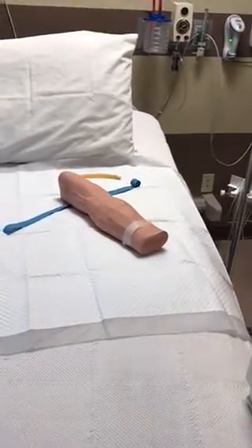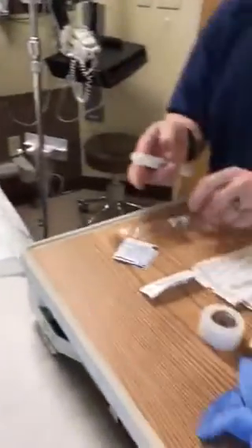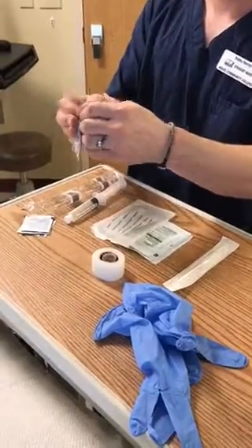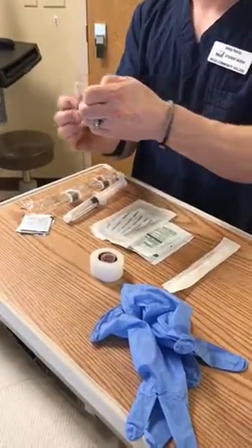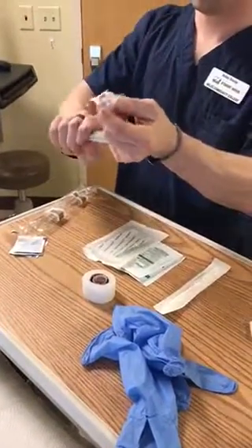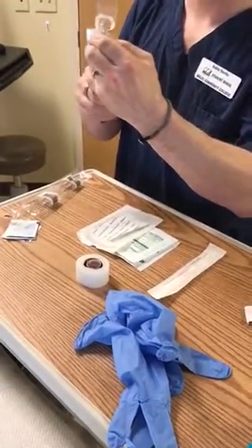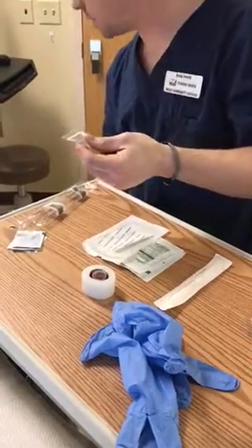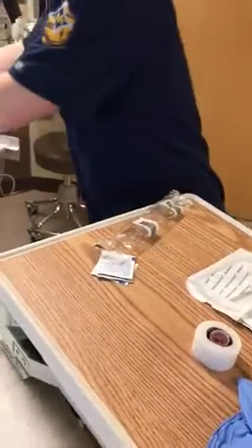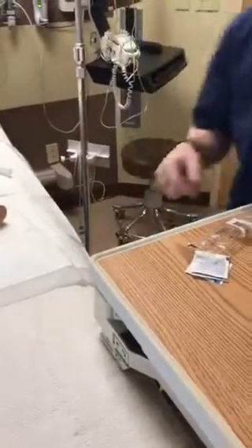And I'm going to prepare my equipment. The bed's already in a nice position for me. And I brought all my equipment with me here. I'm going to pull out the IV site here. And I'm going to flush that into the garbage can to not make a mess. And I'm going to set this right by the bed here in the little gravy boat to keep that nice and clean. Throw that guy away.